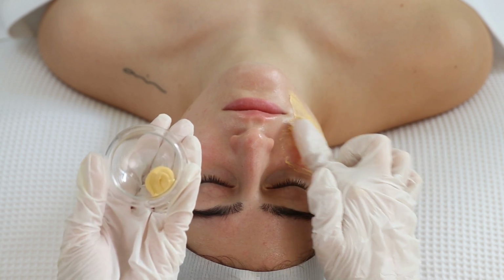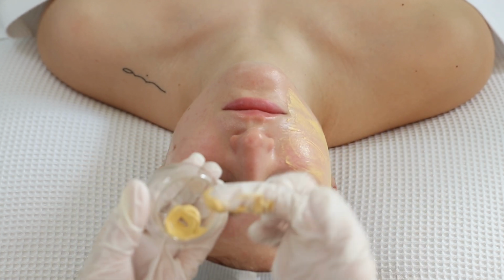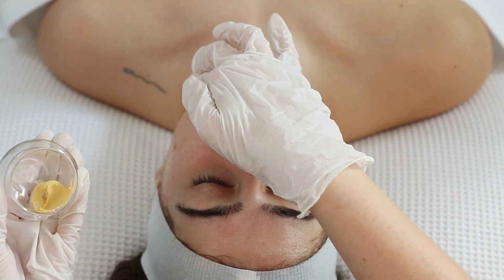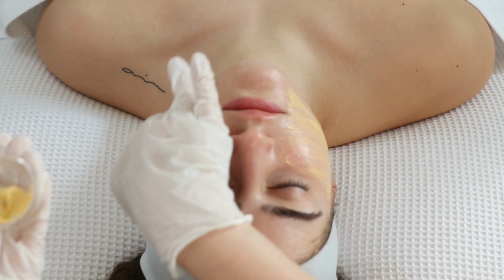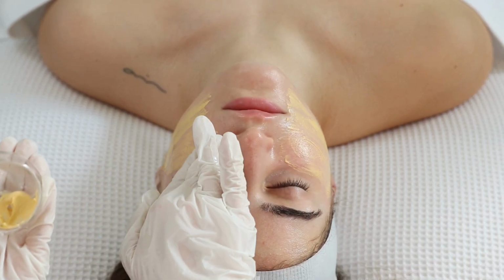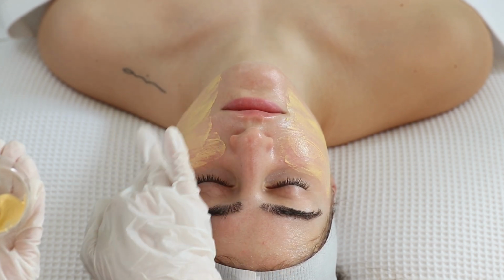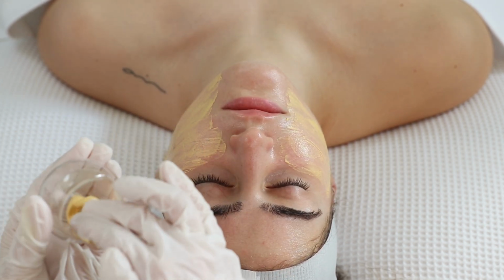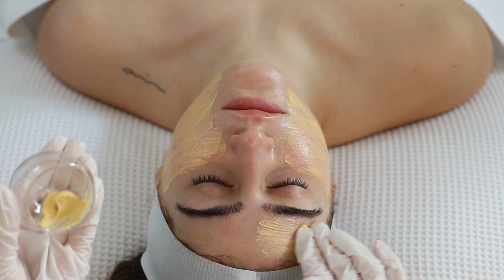Start from the right side of the face from the chin area and move upwards towards the jawline and the cheeks. And once that is done, you can move on to the left side and repeat the exact same process. We actually use the clarify peel mask to ensure that there is no residue left on the skin, and the mask also helps draw out any impurities and prepares it for the chemical peel that we are going to use later on after the dermaplaning.